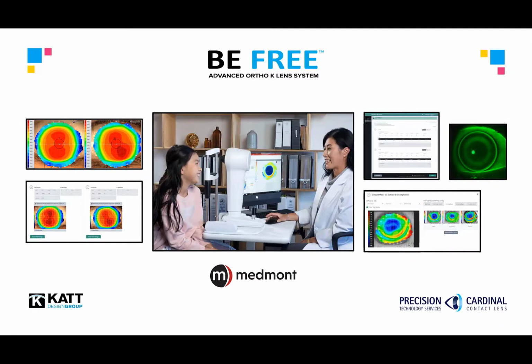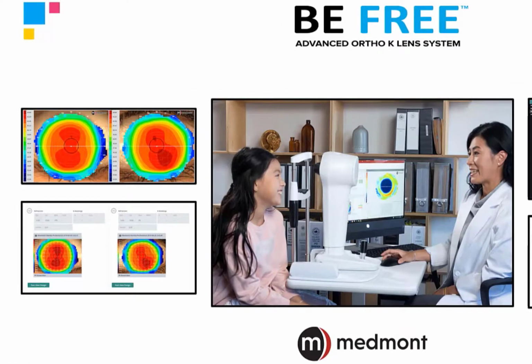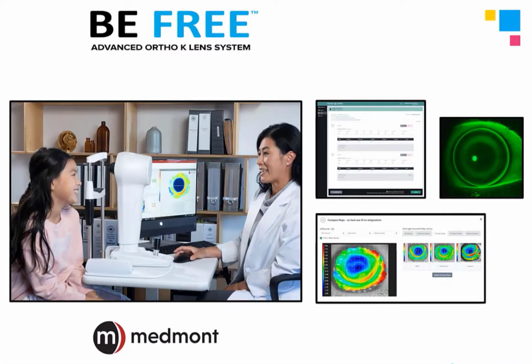BE FREE users without a linked topographer to the software may want to consider the purchase of the Medmont topographer. This marriage of these two systems provides an unparalleled level of accuracy and efficiency in orthokeratology practice.